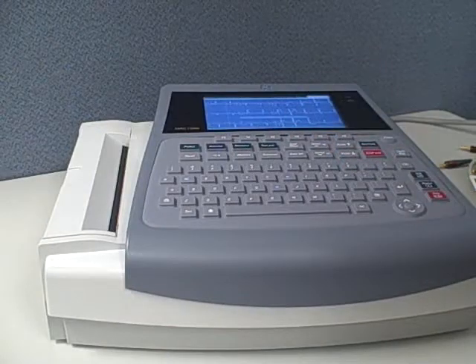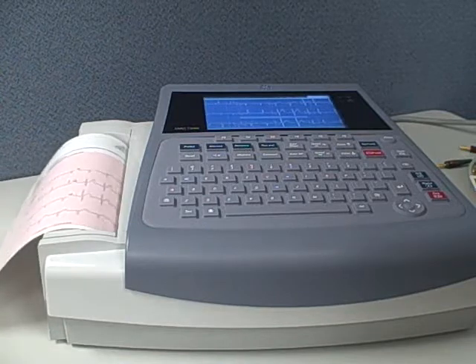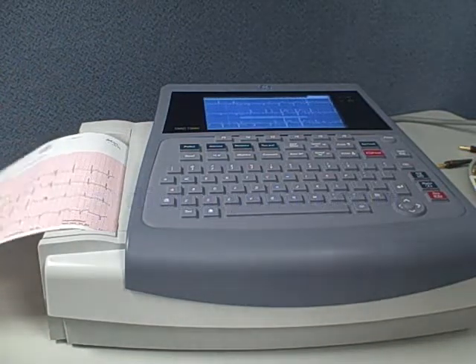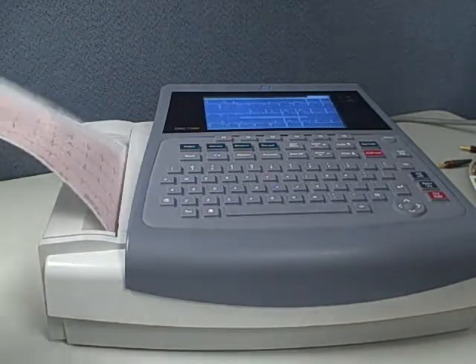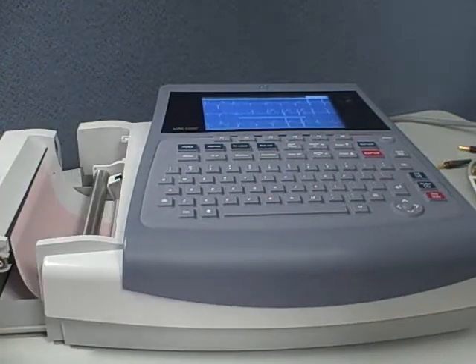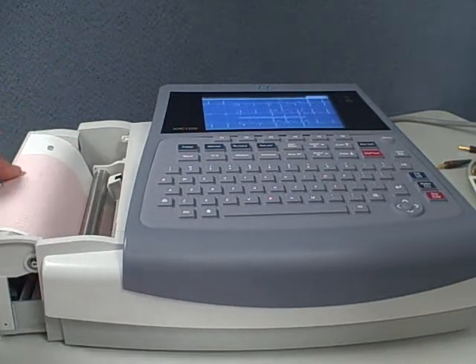Now let's take a look at the operation. Once the patient is hooked up, one touch operation will show all 12 leads coming across and printing off a sheet quickly. The thermal graph paper comes in a pack of a couple hundred sheets that you slide right into the paper canister here, easy in and out.